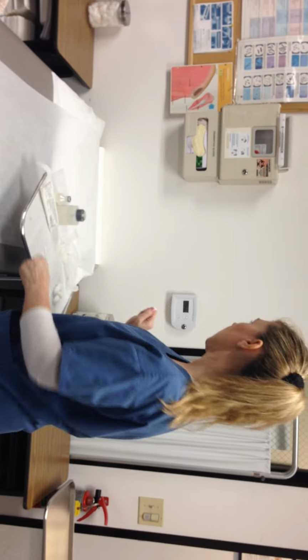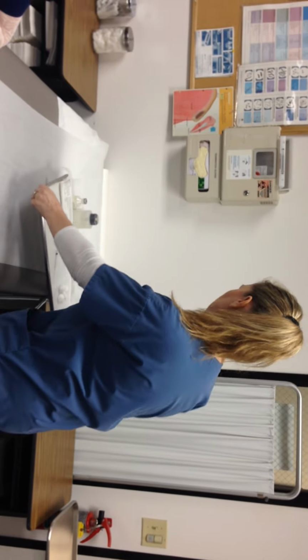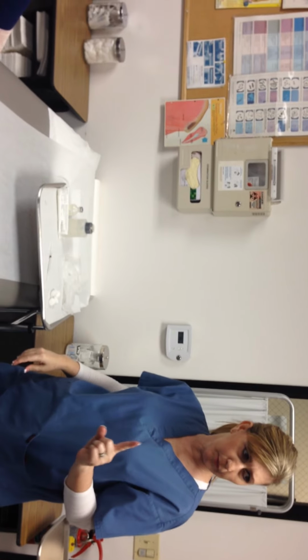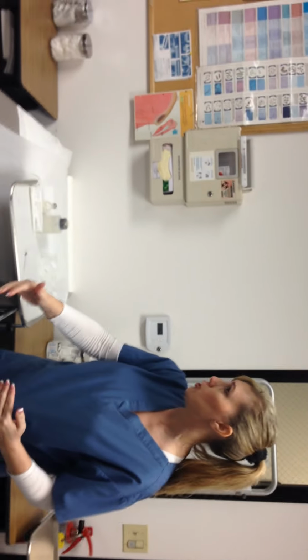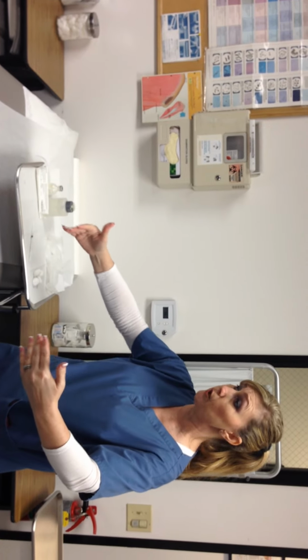So is my sharps container. It's right here, boom. Okay? So I can even move this over just even a little bit more so that I can go like this. Your sharps container always needs to be one step away from you. If it's 2 steps, it's too far. Bring your sharps in closer to you, or yourself, or your patient. Move things around to where you are within reach, where you need to be. Does that make sense? Okay.